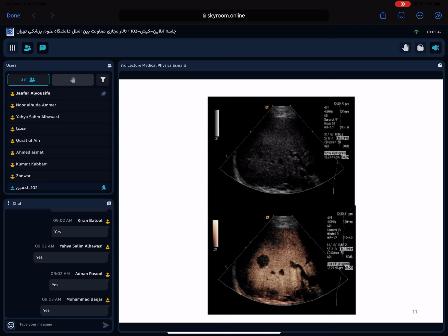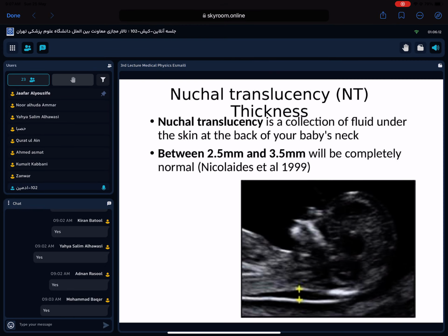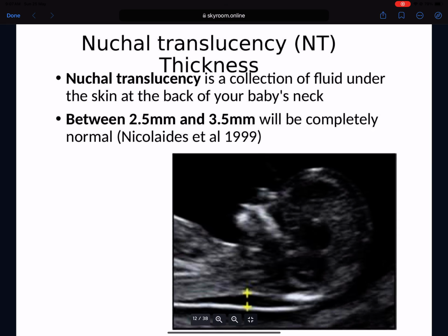And you will see in the lower image, we have a better contrast, we have a colorized image, and we can easily see the 3 or 4 tumoral regions in the liver, which are possible to see in the upper image without contrast, but it's a little bit difficult. So I want to show you also, like normal radiology, in ultrasound you can use some drug to increase the contrast of the images.